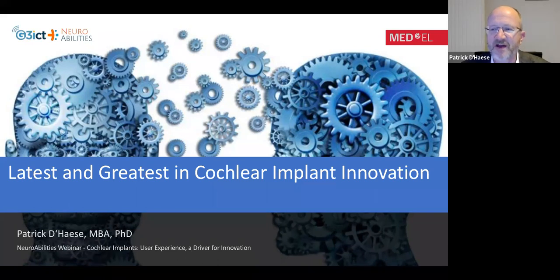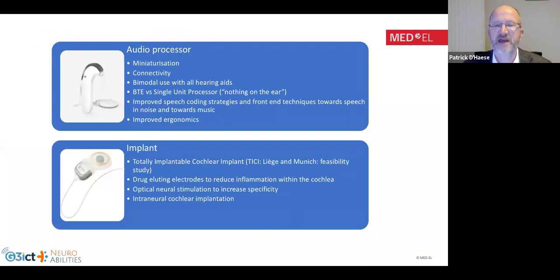Thank you very much, Lidia, for this very kind introduction. It will be my pleasure to tell you something more about the latest and greatest in cochlear implant innovation. If we can move to the next slide. Very often, it is seen that innovations can only take place in the audio processor or in the implant. What I want to highlight over the next couple of minutes is that innovations can happen not just in these two components, but also in other components, like the surgery, the audiology, or indications. Let's first tackle the audio processor.